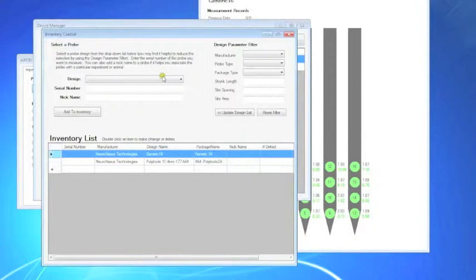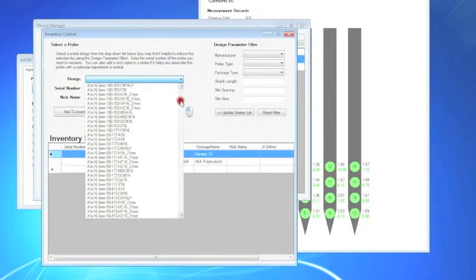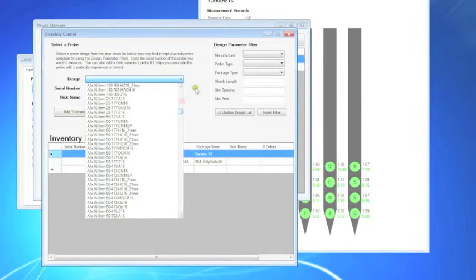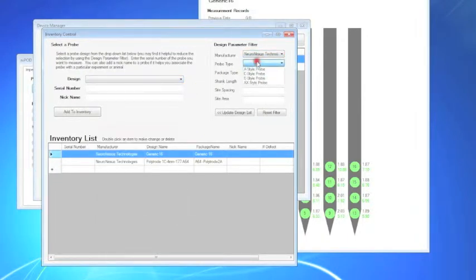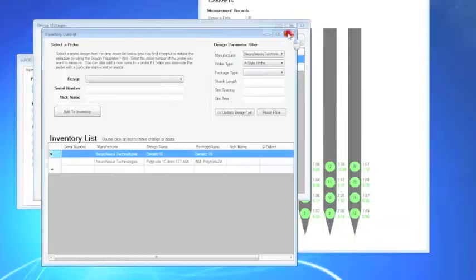To add a probe, you can search through the available probes or you can filter for a specific probe by following the steps on screen. It is helpful to select the exact probe design and package as the electrode sites will be mapped and visualized appropriately.